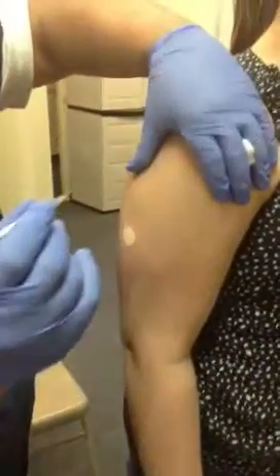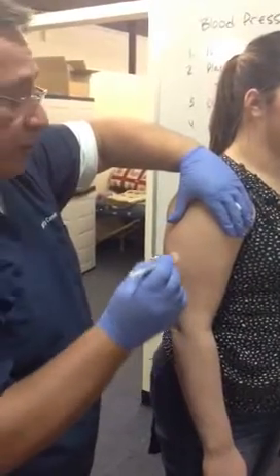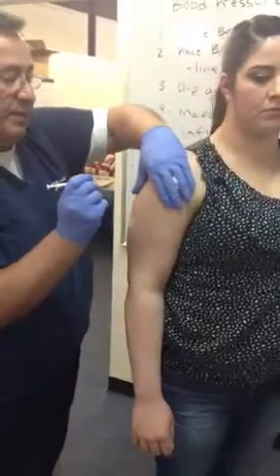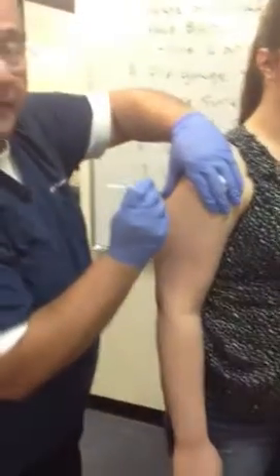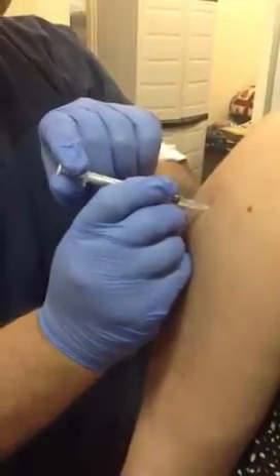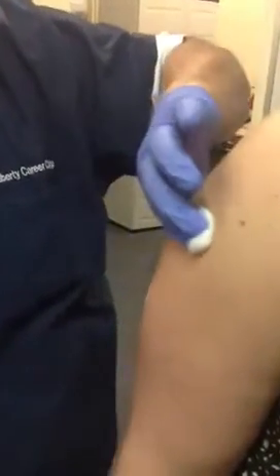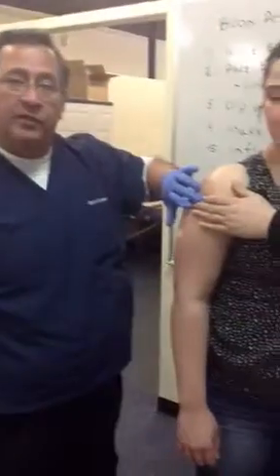Now, with our cotton ball in hand, we're going to go back into the top here. Remember, we don't tent the skin up — we just position our hand to landmark and remind us where we're going to give the injection. I'm going to go in at a 90-degree angle, but first warn the patient: you're going to feel a stick in one, two, three. The needle is in — notice how my hand is anchored down to her arm. We aspirate to make sure we're not in a blood vessel, then inject. Once the medication is injected, pull the needle straight back and out while holding pressure, keeping hands separated. Instruct the patient to hold pressure while you take the needle to the sharps container and drop it in — notice I didn't cross my hands.